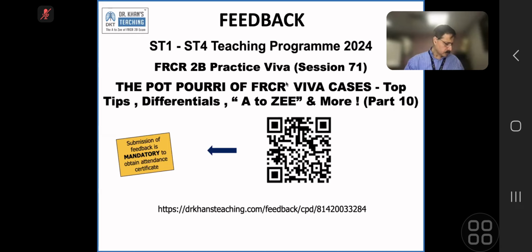Then there was subarachnoid hemorrhage on FLAIR. Then sigmoid carcinoma, mucinous, with a huge mass going deeper into the pelvis, into the cul-de-sac. Then there was leptomeningeal enhancement in another brain, and then sigmoid carcinoma with vesical fistula. So these were the cases.